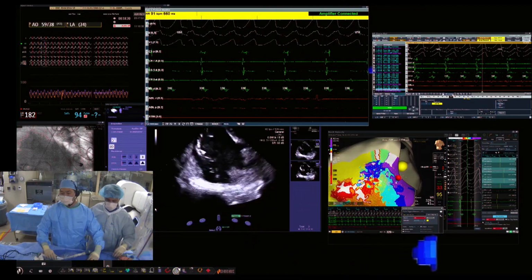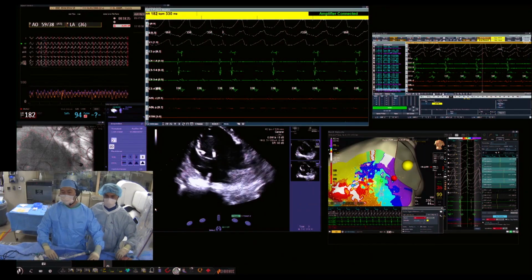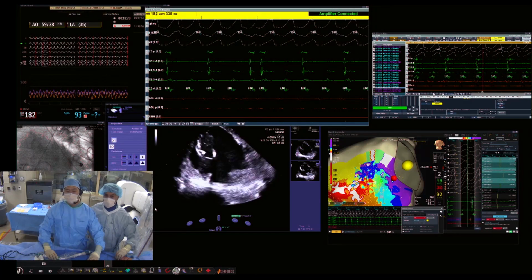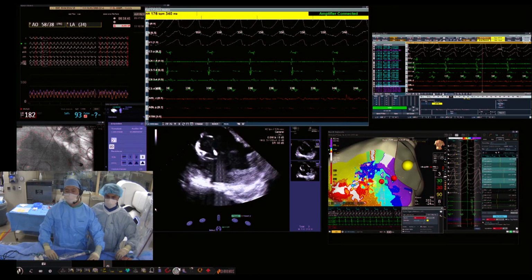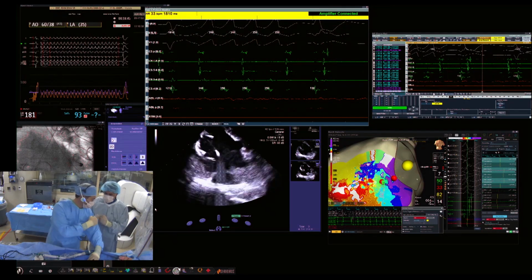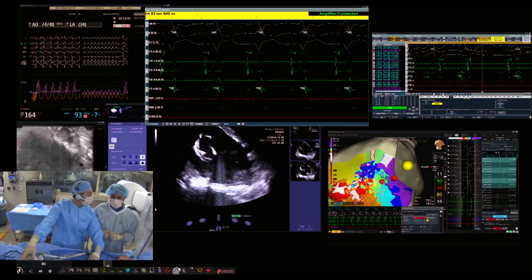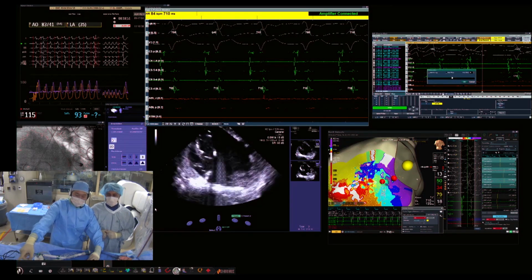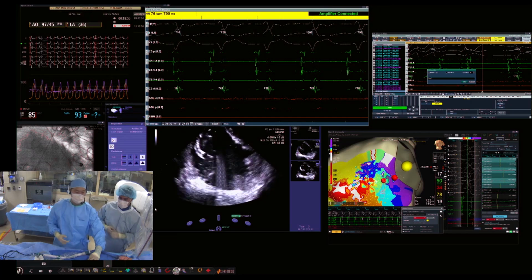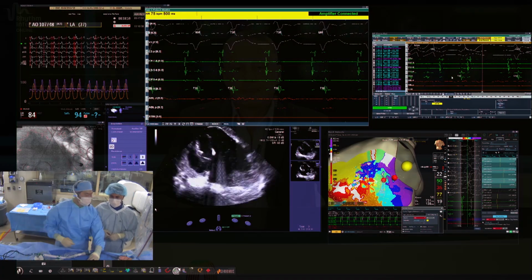One push or something here. On ablation here, please. 50 watts. Got it. That's it. Right at the freaking exit site. And that's what we had, right? Green coming out. If we had that live, it would have been it. That's it. But we nailed it, right? Because it's surfacing just on the other side.